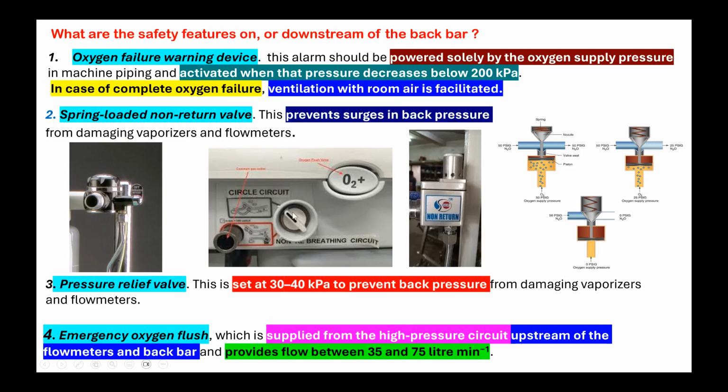And you can see this is the modern anesthesia machine circuit selector, like what you have here between open and closed system. Here you have non-rebreathing and circle system or rebreathing system. So when the pointer is in this situation, you will go to the circle absorber with the circle system. When you turn this towards this pointer, you can attach your Jackson Rees or other Bain circuit. You can go to the open system or the non-rebreathing system.